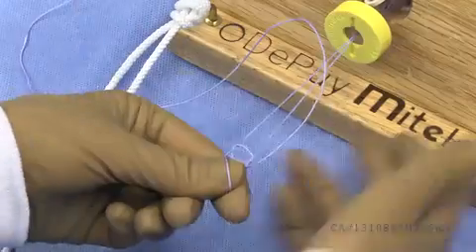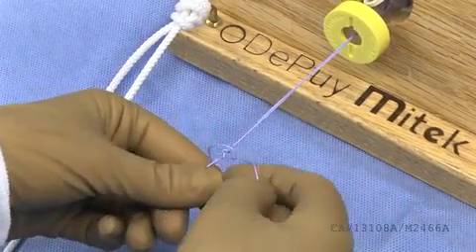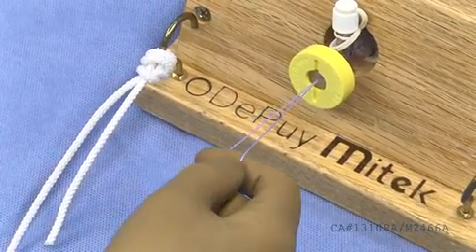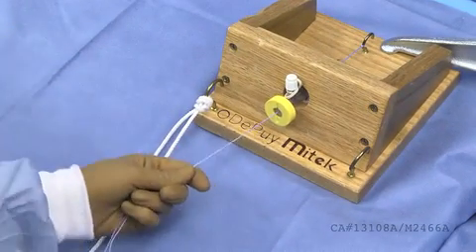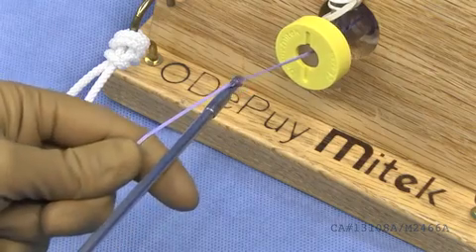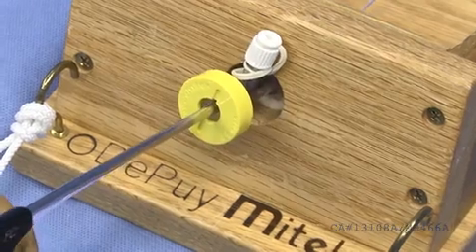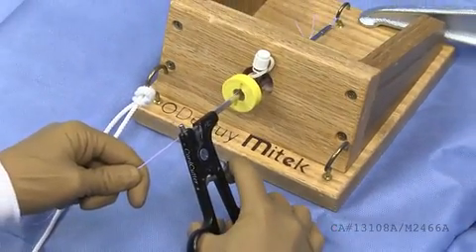Throw three overhand loops. Slide the suture through the thumb hole, as seen here. Slowly dress the knot and pull on the post strand of the suture to slide the suture to the desired location. Using the cord cutter, place your sutures through the slotted distal end of the cutter, close the jaws of the cutter, zip line down to the knot, and finally pull the trigger to cut the suture above the knot.